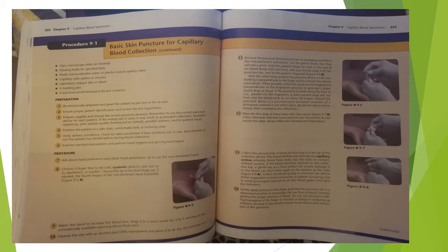Position the patient in a safe chair, comfortable bed, or reclining chair. Verify dietary conditions. Check for latex sensitivities, if latex products are in use, and whether or not the patient has fainted before or during blood collections. Exercise standard precautions and perform hand hygiene and gloving techniques.